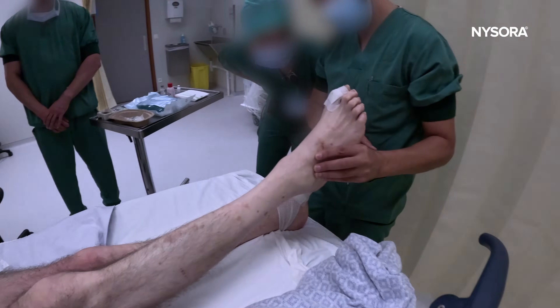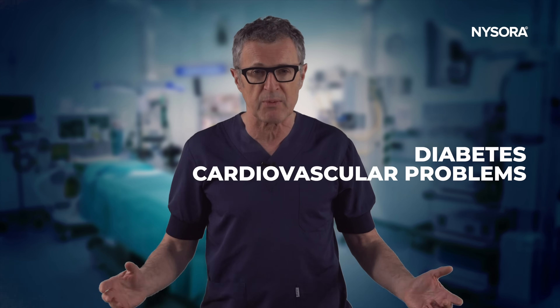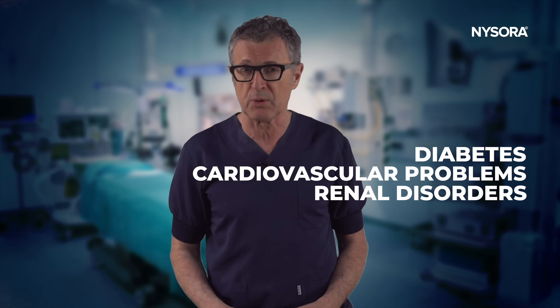This patient is undergoing a major lower extremity amputation — above knee amputation. This technique can also be used for below knee amputations. These patients typically present with multiple comorbidities, including diabetes, cardiovascular problems, and renal disorders, which increase their risk for significant postoperative complications.